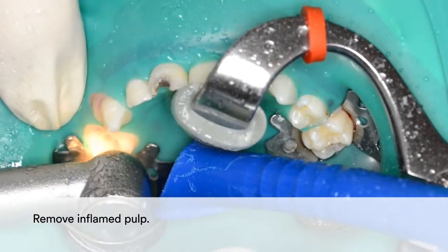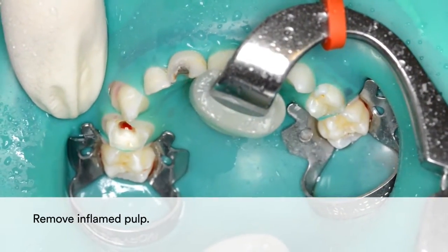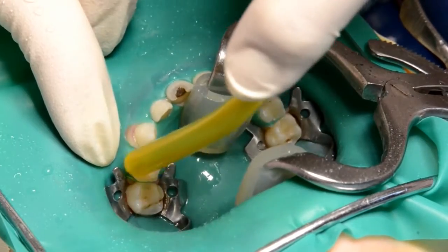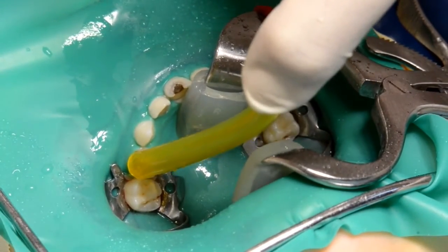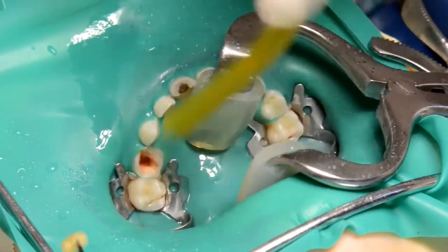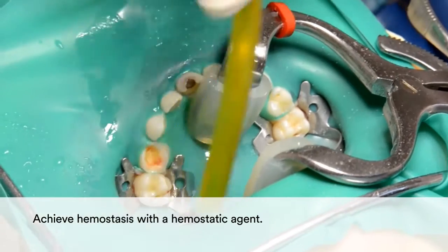Then remove the inflamed pulp. If bleeding occurs, use a hemostatic agent to control it.